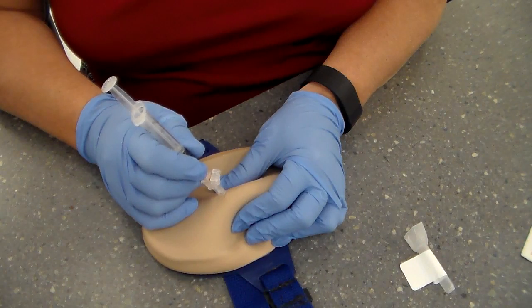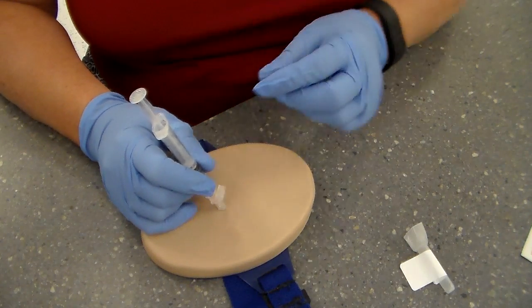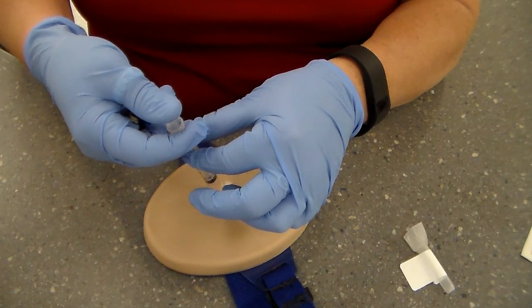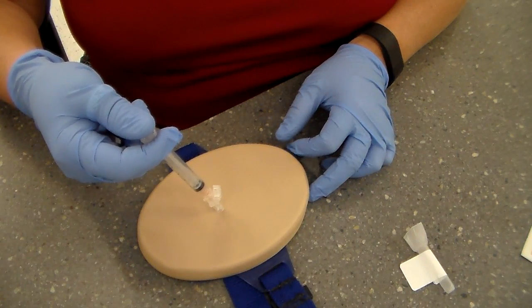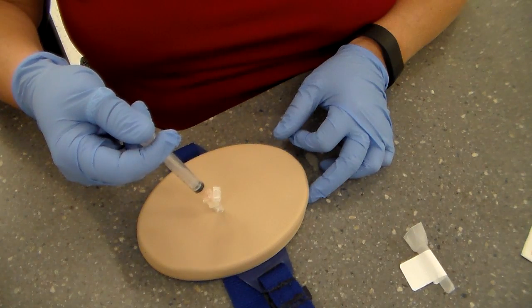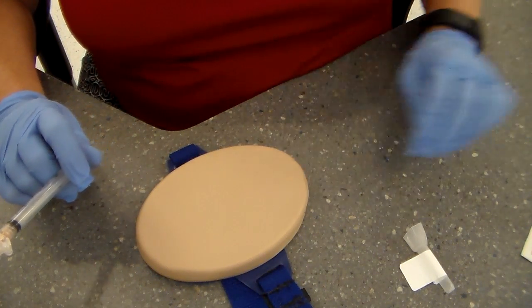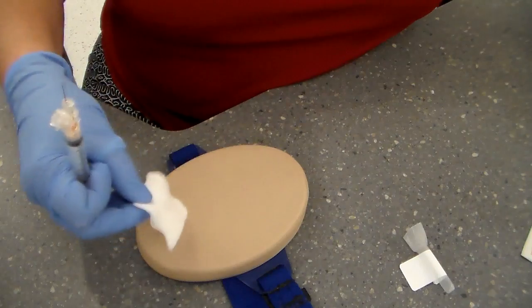When you have the needle in the skin, you're going to let go. You're not going to hold the skin for this. You're going to inject the medicine. Slow and steady. And then you're going to hold it to a count of 10. 1, 1,000, 2, 1,000, 3, 1,000, and so on, up to 10. And withdraw.